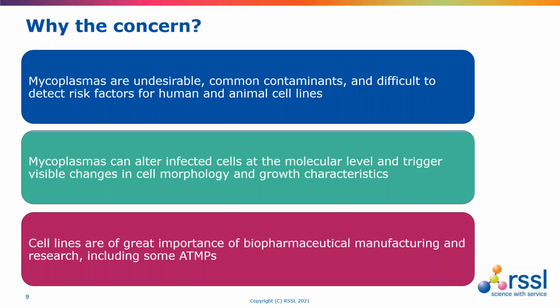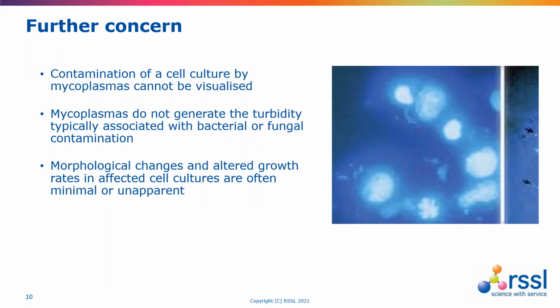And just to continue on the point about visualization, this is very different to other forms of more typical bacterial or fungal contamination. It is important to emphasize that contamination of a cell culture by mycoplasmas cannot be visualized, so it won't generate the turbidity that we can often use as a detection method.